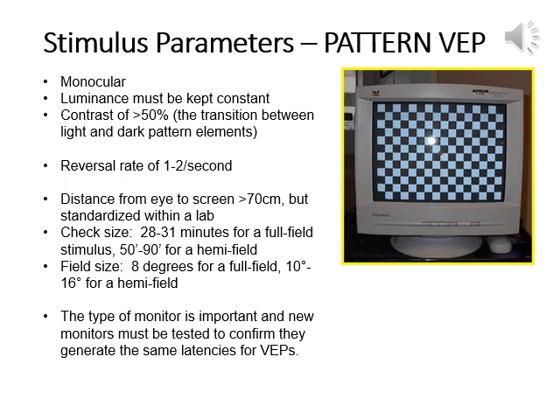The luminance, that is the brightness of the stimulation, as well as the contrast, the brightness between the black and white checkerboards, must be known and standardized. And so this is something that medical engineering should standardly do, is confirm the monitor has the right luminance and contrast. The reversal rate of the checkerboard between the black and whites is typically at about 1 to 2 reversals per second.